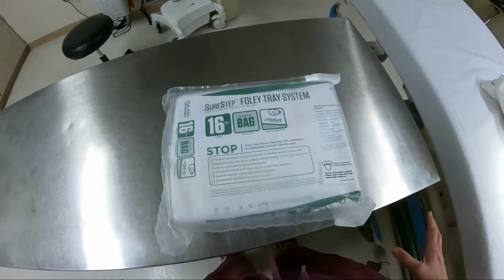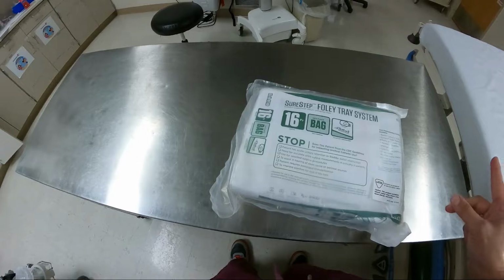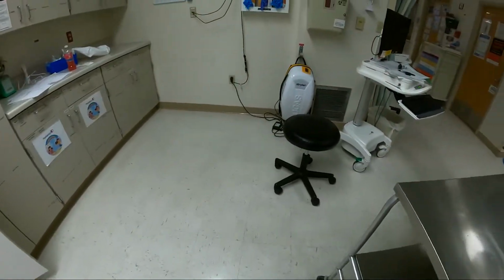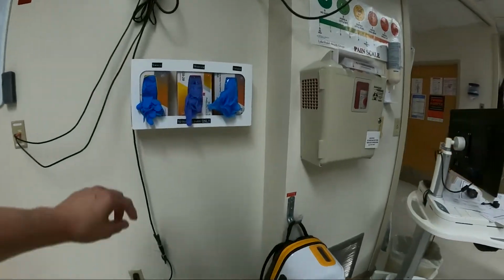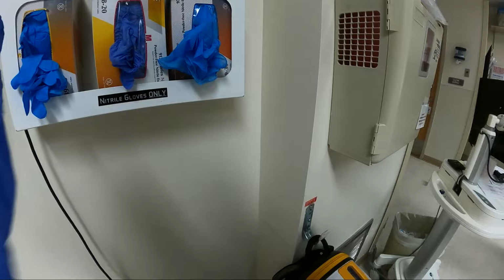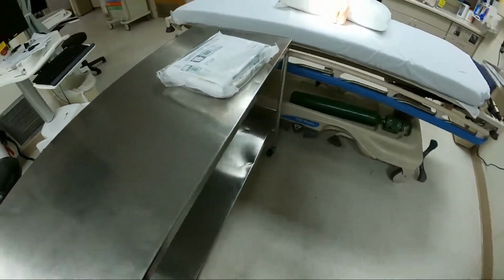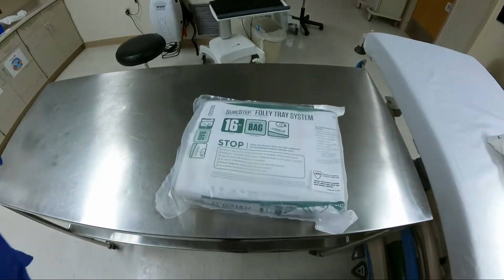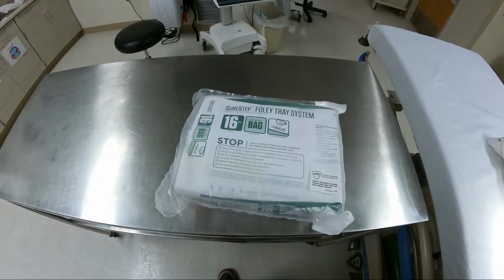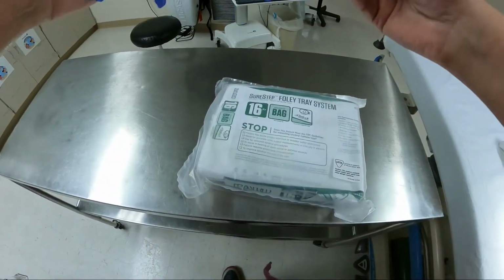So the first thing we're going to do is put on gloves. So give me a second to run over here and get our gloves. And we're going to do hand hygiene. Besides line placement, there's no other time that hand washing could be nearly as important as when you're putting in a Foley. So wash your hands, put on gloves.